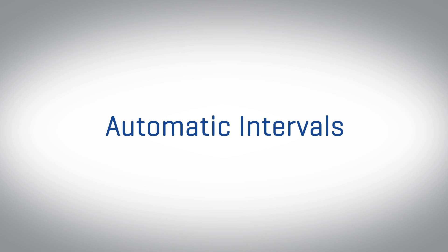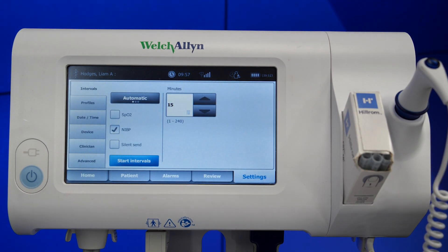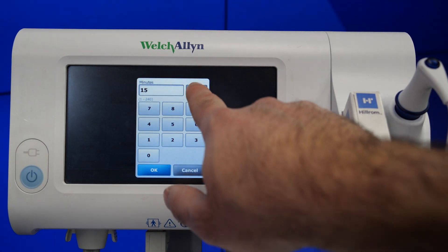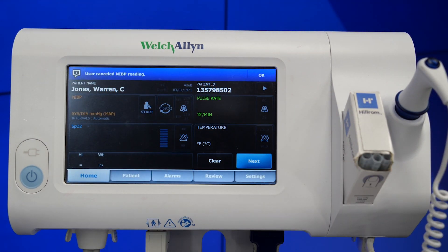Starting with automatic intervals, this will take NIBP and SPO2 measurements at a consistent timeframe, for example every 60 minutes. Begin by selecting the interval's clock icon, then select automatic. You'll then use the numeric keypad to enter the length of time between NIBP measurements and touch start intervals. These readings will continue until the user physically stops them.